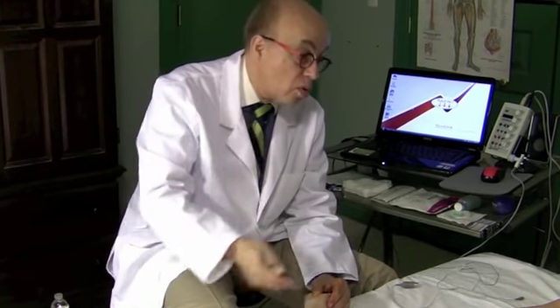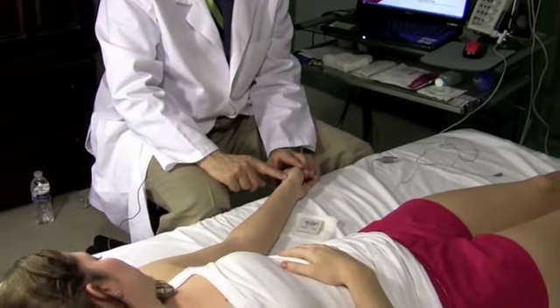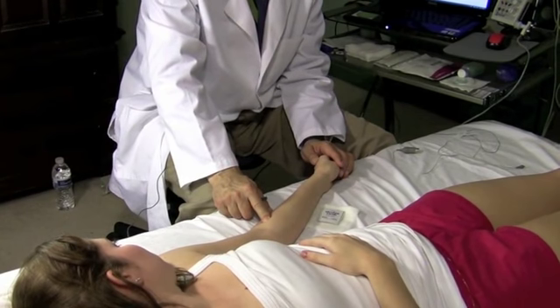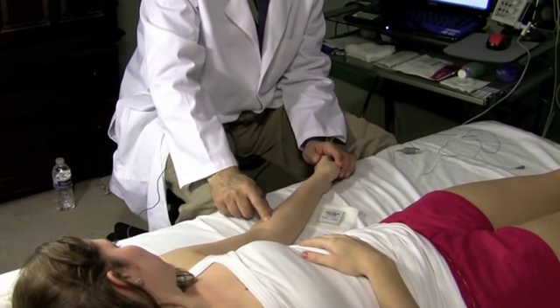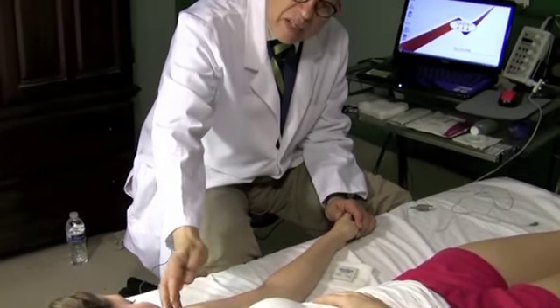So the idea behind selecting what muscles to study is to choose the ones that will show you whether it's a nerve lesion or a root lesion coming from the back of the neck or from the low back essentially. And that's why I choose the muscle. For that reason, in the arm, I choose some ulnar muscles, some median muscles, some radial muscles, because remember in the nerve conduction studies, we study median, ulnar, and radial. Then I study the triceps, which is radial innervated, and the deltoid, which is axillary innervated, C5-6.